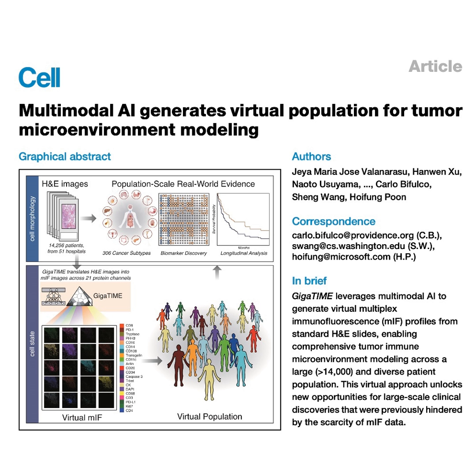Entropy was the big winner. It improved the statistical strength of the association in 89 different biomarker pairs. It tells us that how the cells are arranged is often more important than just how many there are. That's incredible. So from spatial structure to combinatorial analysis, what happens when you start looking at how these 21 proteins work together? This led to one of the most exciting findings.